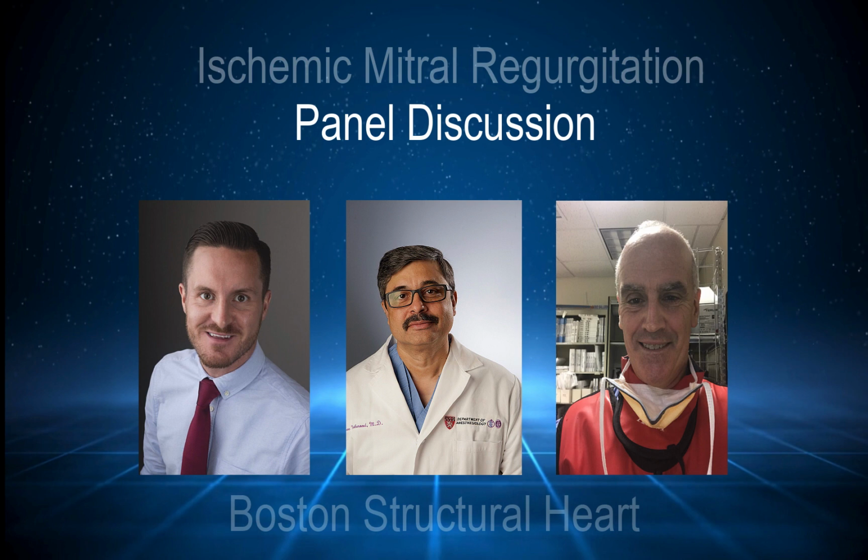That's true. So if you're going to tell the surgeon or proceduralist to do something based on what you've done, you should quantify. And I guess if it's torrential, you could eyeball that and just say, oh, it's torrential. And a ruptured pap muscle, probably not much you have to quantify there. It's a ruptured pap muscle.